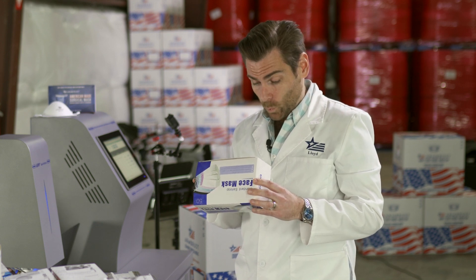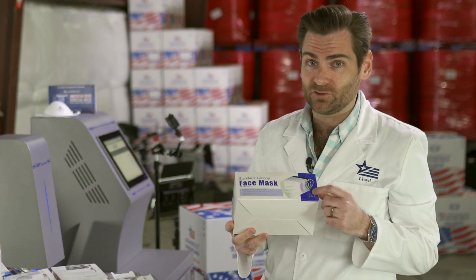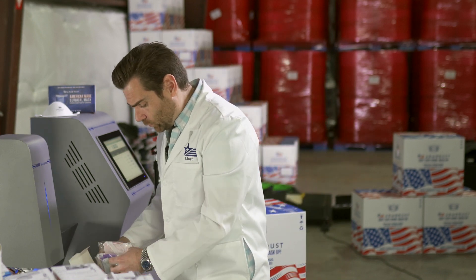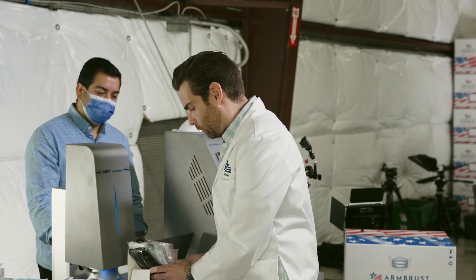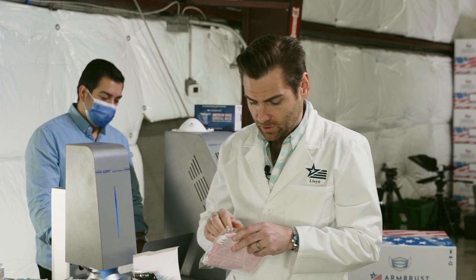Looking at the box first: lightweight, comfortable to wear — we'll see about that — disposable, hypoallergenic, three-layer, water repellent. Fun fact: the FDA doesn't want you to say that unless you're a registered face mask, which this is not. The packaging is really cool — they've got five different colors in here, and we're testing the pink.